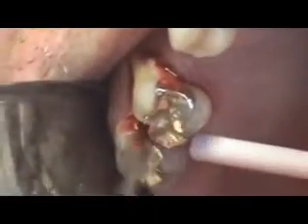Open it real big. Put the camera on. Rob, you got the shot going? It's a little white from the light. How about now? Oh, there we go, that's perfect. Am I on the right tooth? That was a joke. All right, I'm ready.